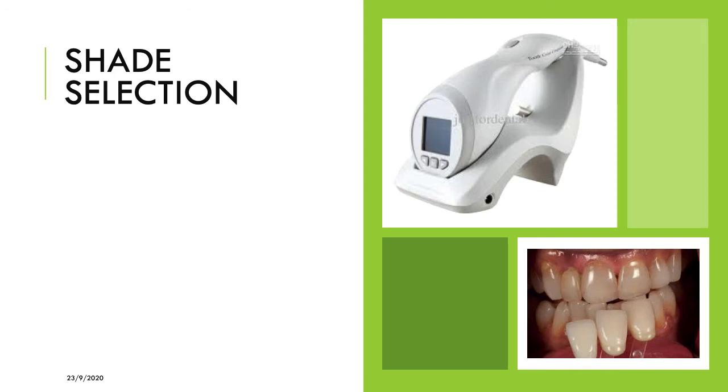one, it's something like a composite head. So you have to take that digital Vita shade guide, then you have to snap on the infection control tip to the tip of the instrument. After that, you have to place that head into the machine and calibrate. You just place it, and it calibrates automatically.